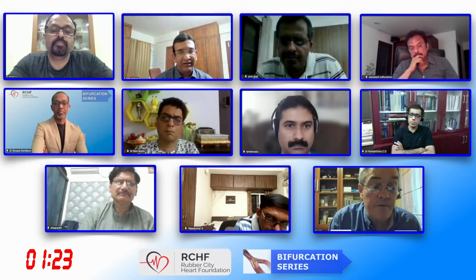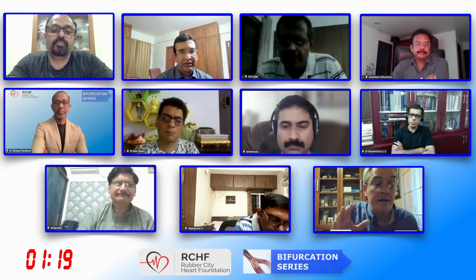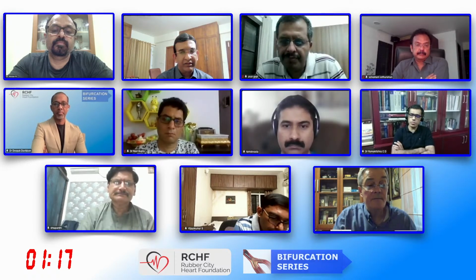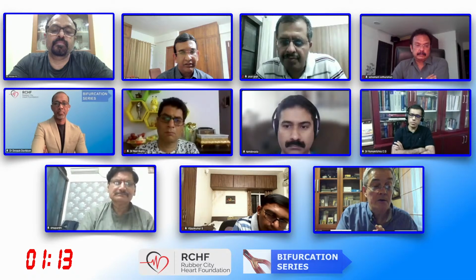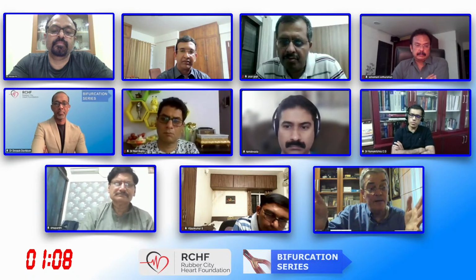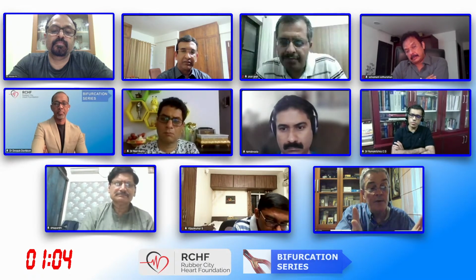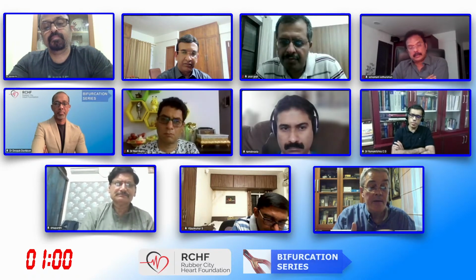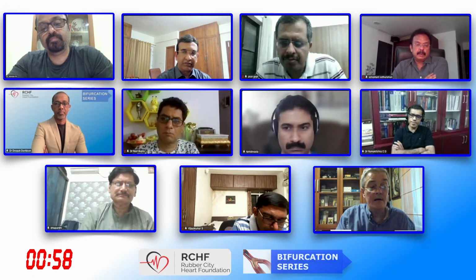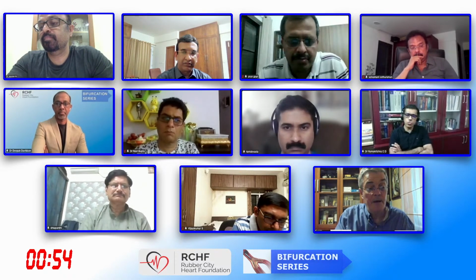I don't think so. First, for us, whenever you have to crush something, even for a short segment, creating 3 layers of metal is not good. So with T-tap, if you do it with 2 balloons, minimize the protrusion and finish with kissing, I'm not convinced that inverse crush will give you a better result than T-tap.